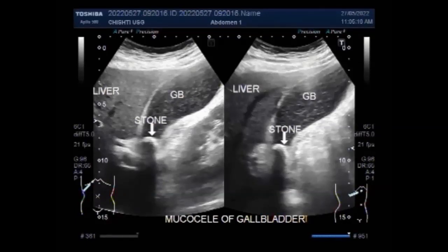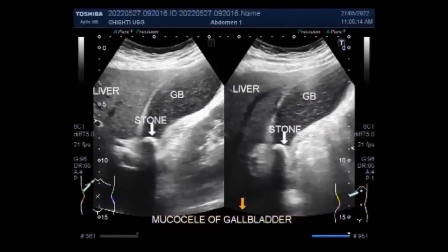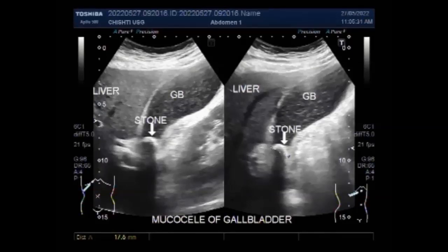This is the mucosal of the gallbladder with the stone impacted in the neck of the gallbladder. The gallbladder is over-distended and the whole length of the gallbladder has a large amount of thick sludge in it.